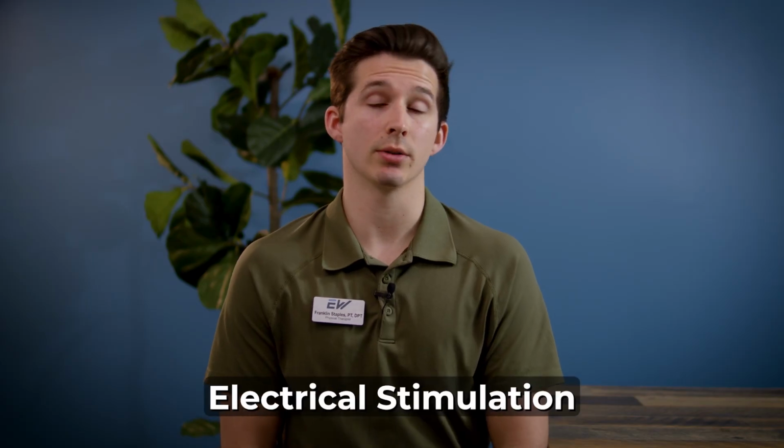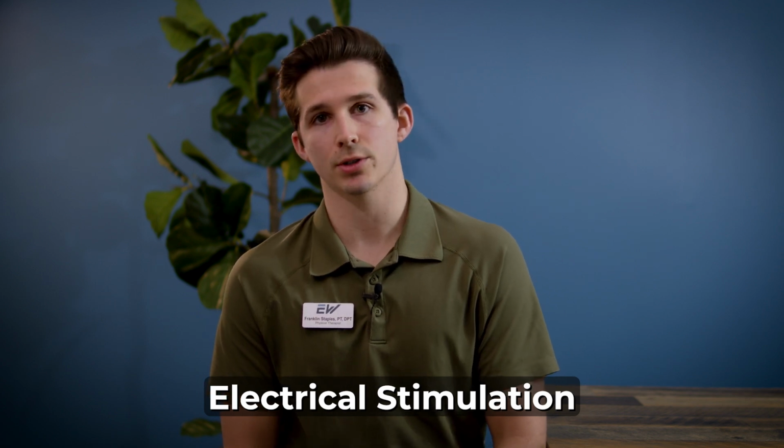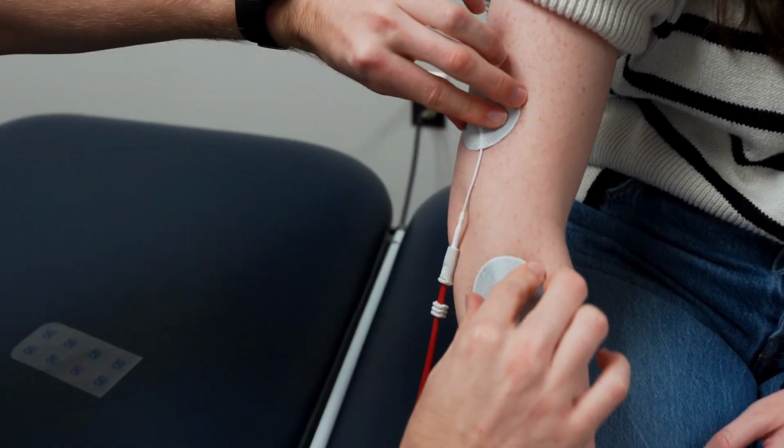Electrical stimulation utilizes electrodes to help stimulate sensory fibers or motor fibers within a certain tissue, and there are two different forms of electrical stimulation. The first includes TENS, which stands for transcutaneous electrical nerve stimulation. And this form primarily goes towards sensory effect, which can help reduce pain in a short-term or long-term way.